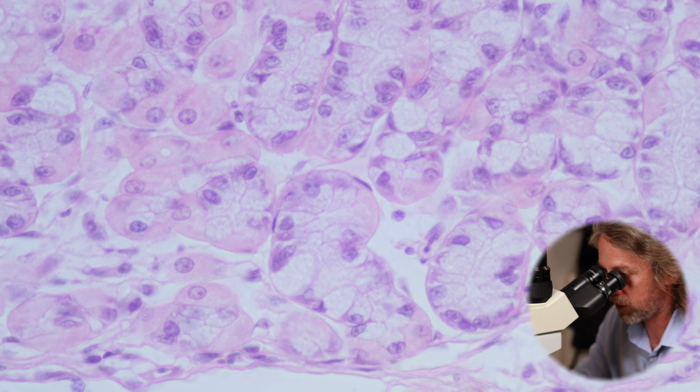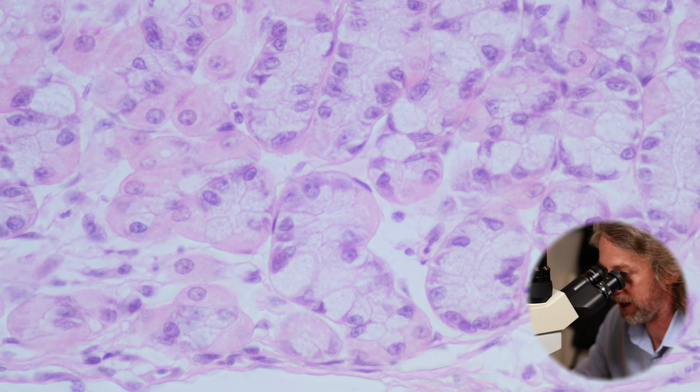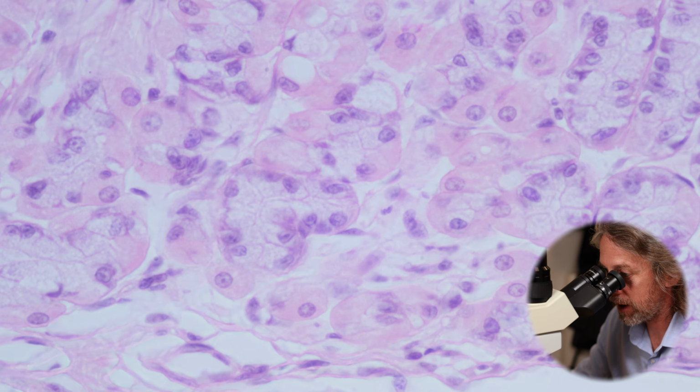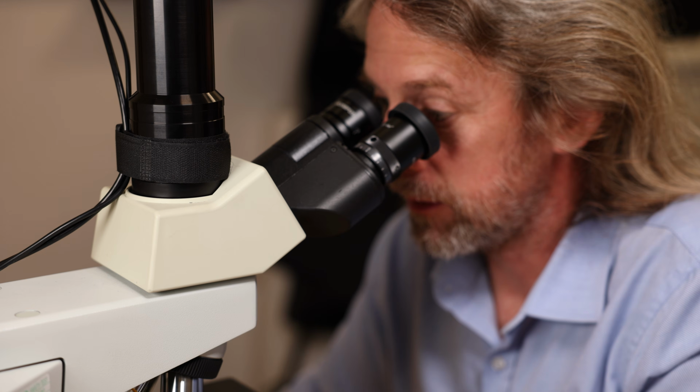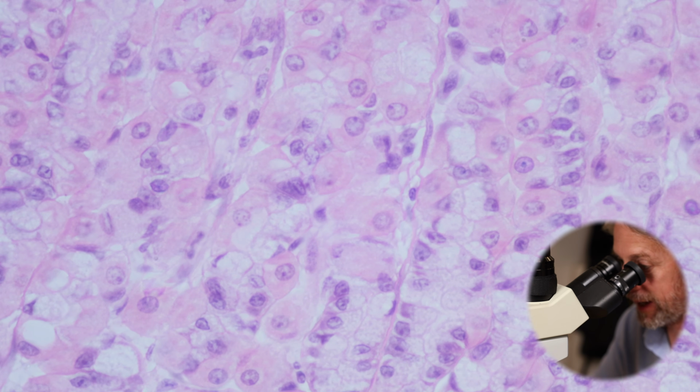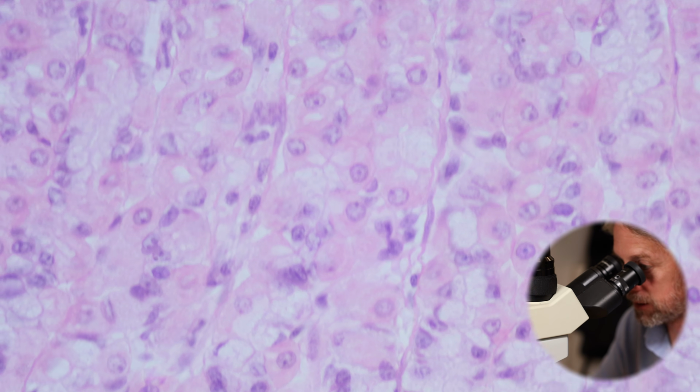So those cells are not pinky, they've got a bit of a purpley cytoplasm. We can see some little marks in the cytoplasm. And the nuclei are still fairly round, but maybe not so much in the middle. So those are the two main types of cells that we're looking at here. So which is which? Which are the chief cells, and which are the parietal cells? Well, the parietal cells that are making hydrochloric acid are the pinky fried eggs.